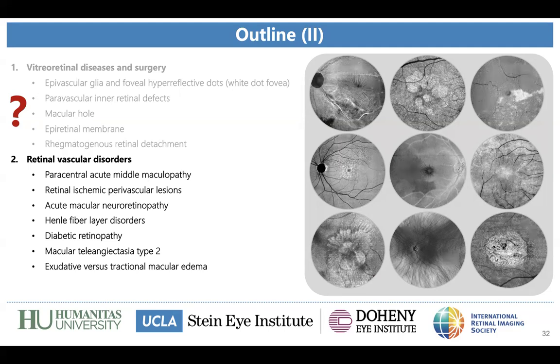Thanks so much, Gabriel. So nice to meet you as well. Unfortunately, this is a limitation of en face OCT, especially where we need very precise and high-volume scans, or in certain conditions such as high myopia, or when there are very high PEDs, for example in polypoidal choroidal vasculopathy. It is very difficult to segment and have reliable information in these cases.